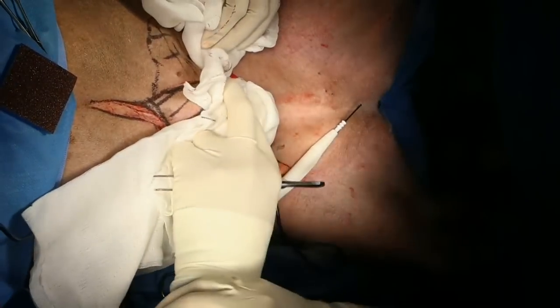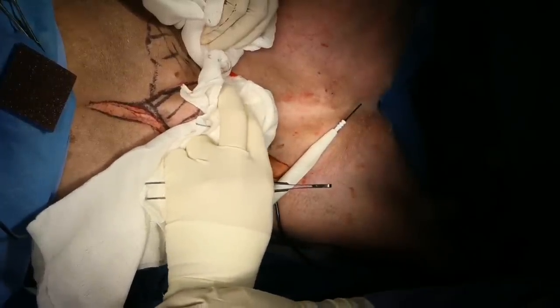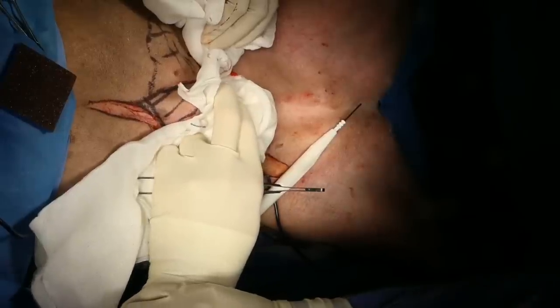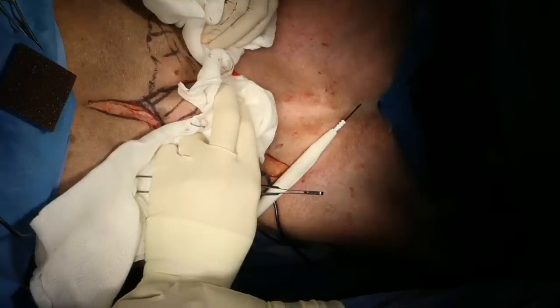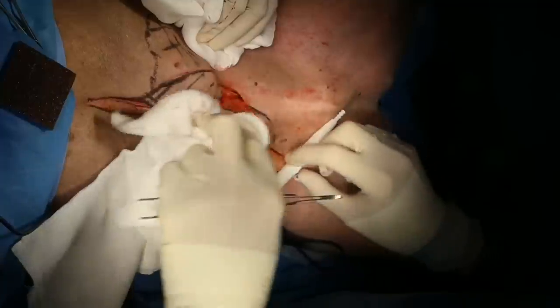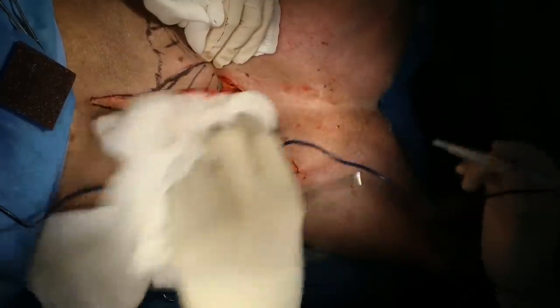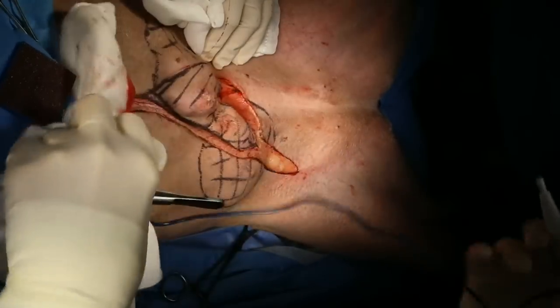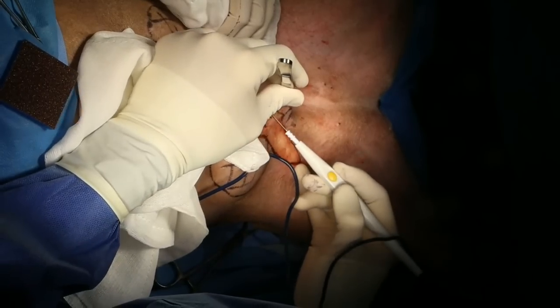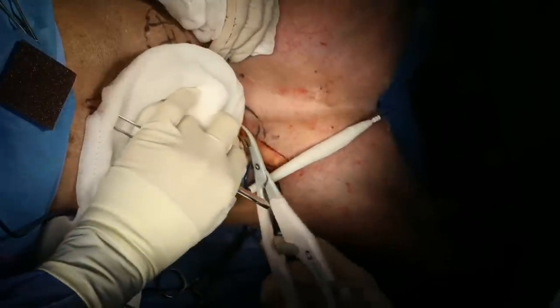Take a minute. You're giving some more propofol. While we're waiting for a little bit more propofol to be given, can I increase the CRI? Yes. Yeah, we've got her on a fentanyl CRI, but we may just have to increase it a little bit. You can imagine that this is a big deal as far as the surgery and discomfort during the procedure. And as always, we're battling hypotension versus depth of anesthetic.